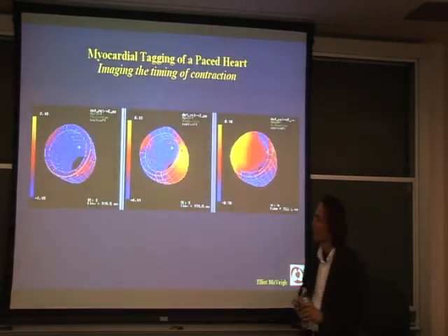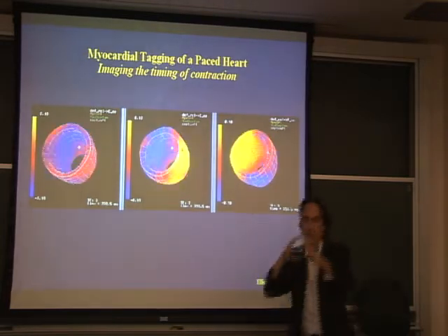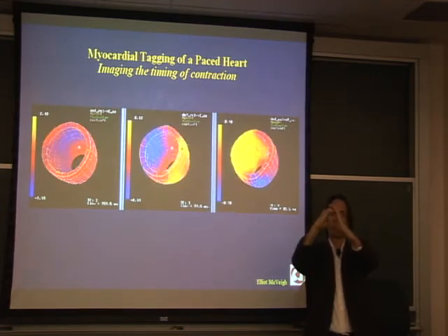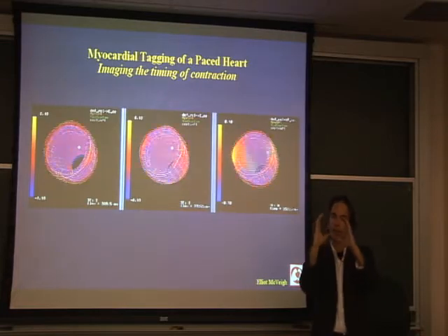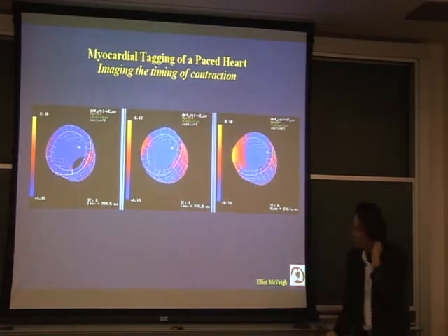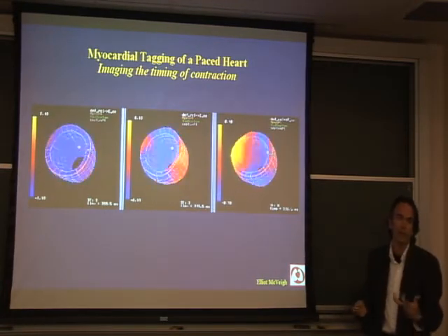And when you make that measurement, let's say circumferential shortening, when the heart contracts, obviously it starts with a cylinder like this, roughly, and then it contracts down and the circumference gets shorter. And that happens locally. At each point in the myocardium, you measure that circumferential shortening. So when you do that and color code it, you can make maps like this, which are mechanical activation maps.